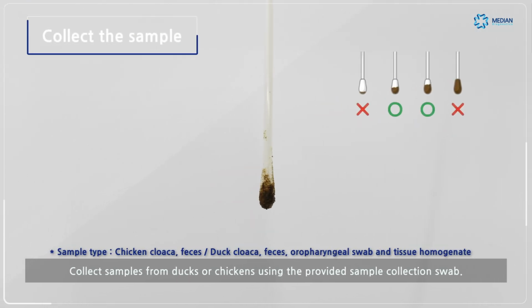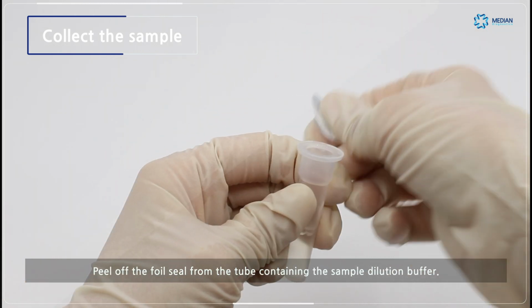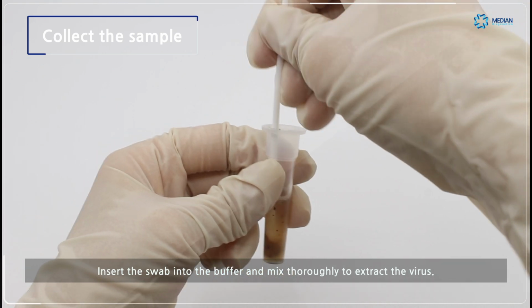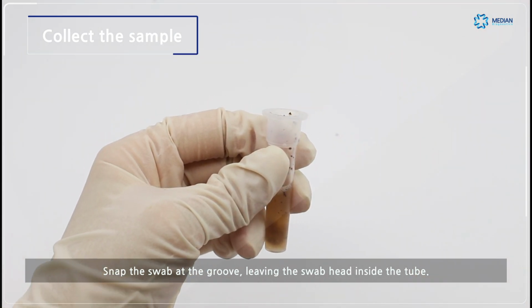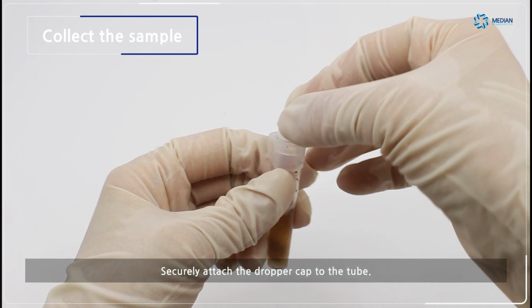Collect samples from ducks or chickens using the provided sample collection swab. Next, peel off the foil seal from the sample dilution tube. Then, insert the swab into the buffer and mix thoroughly to extract the virus. Snap the swab at the groove, leaving the swab head inside the tube. Securely attach the dropper cap to the tube.